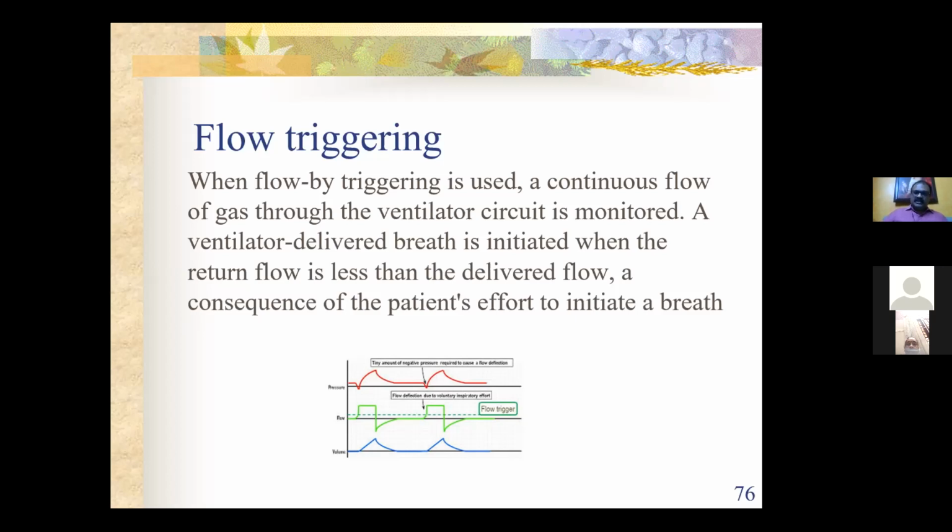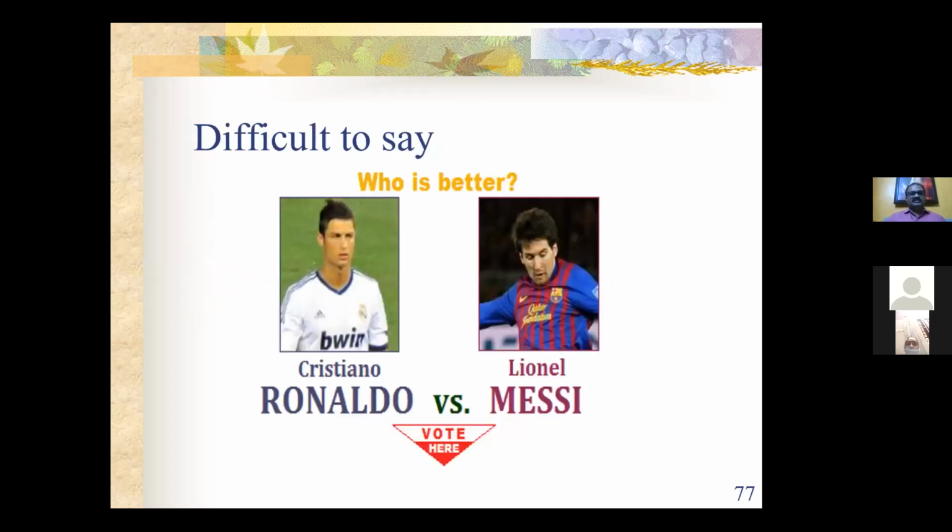So earlier we used to say that the flow trigger is better, but nowadays both are the same. It's difficult to say which one is the better one. Both are equal. Maybe there is some theoretical advantage for a flow trigger, but usually it's the same nowadays because of the better machines.